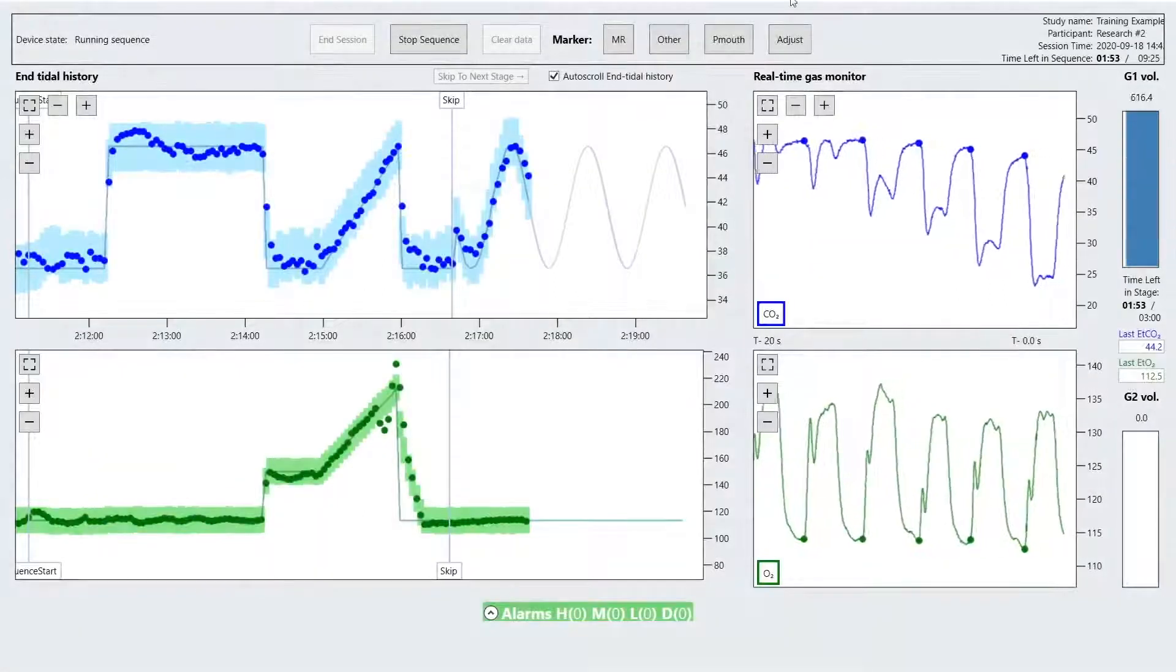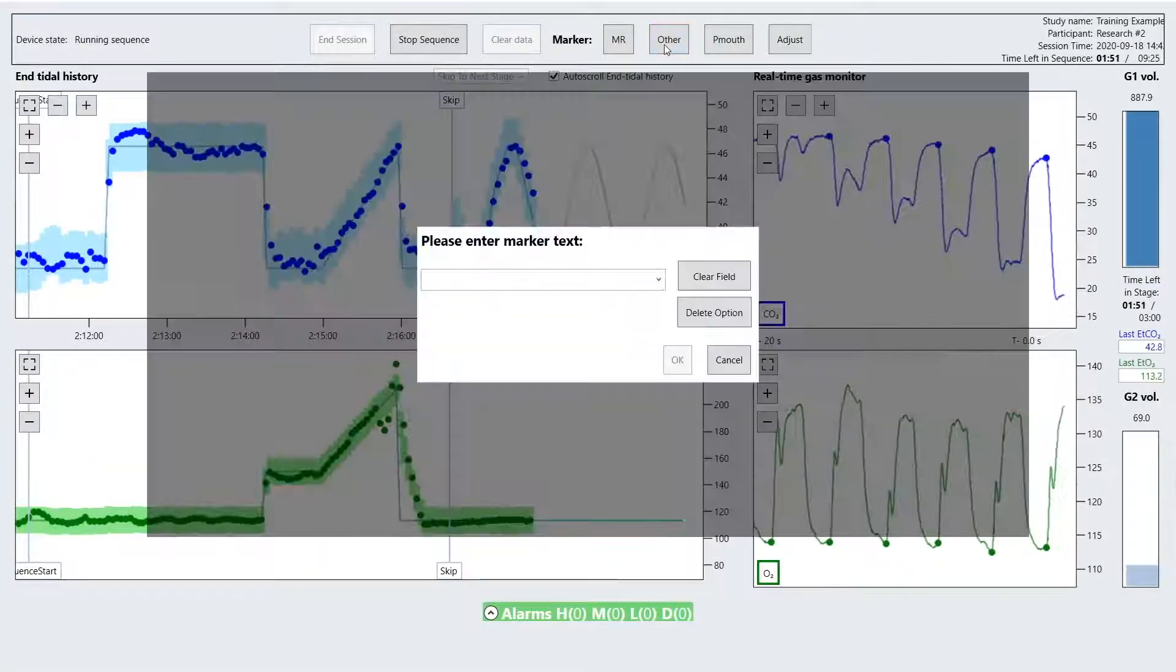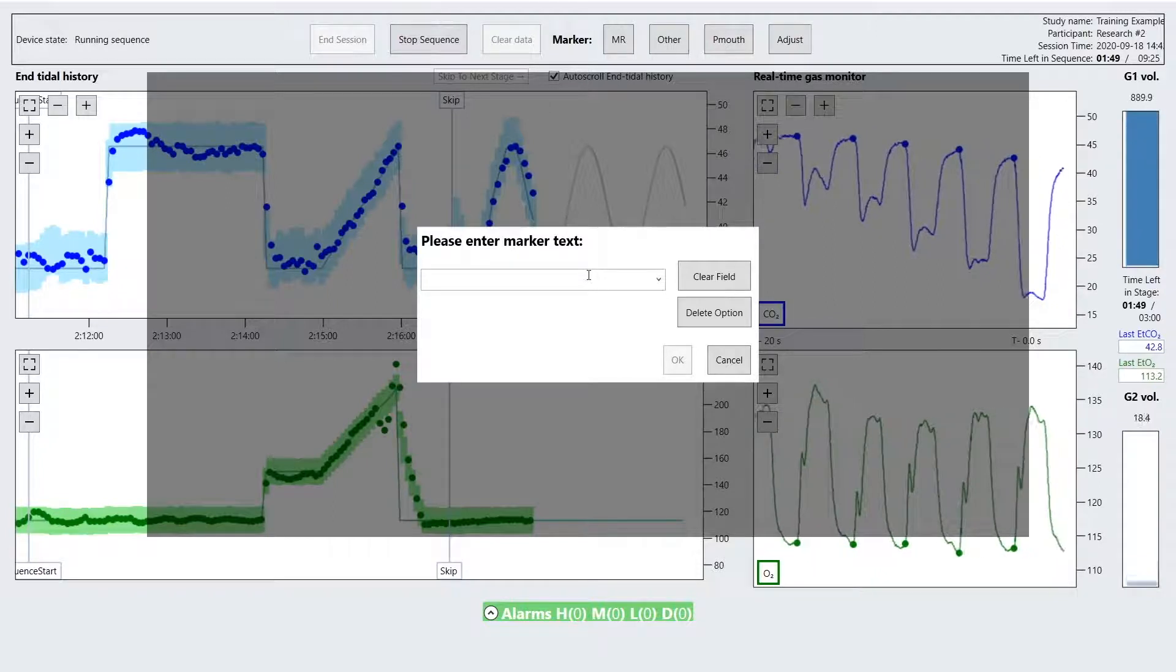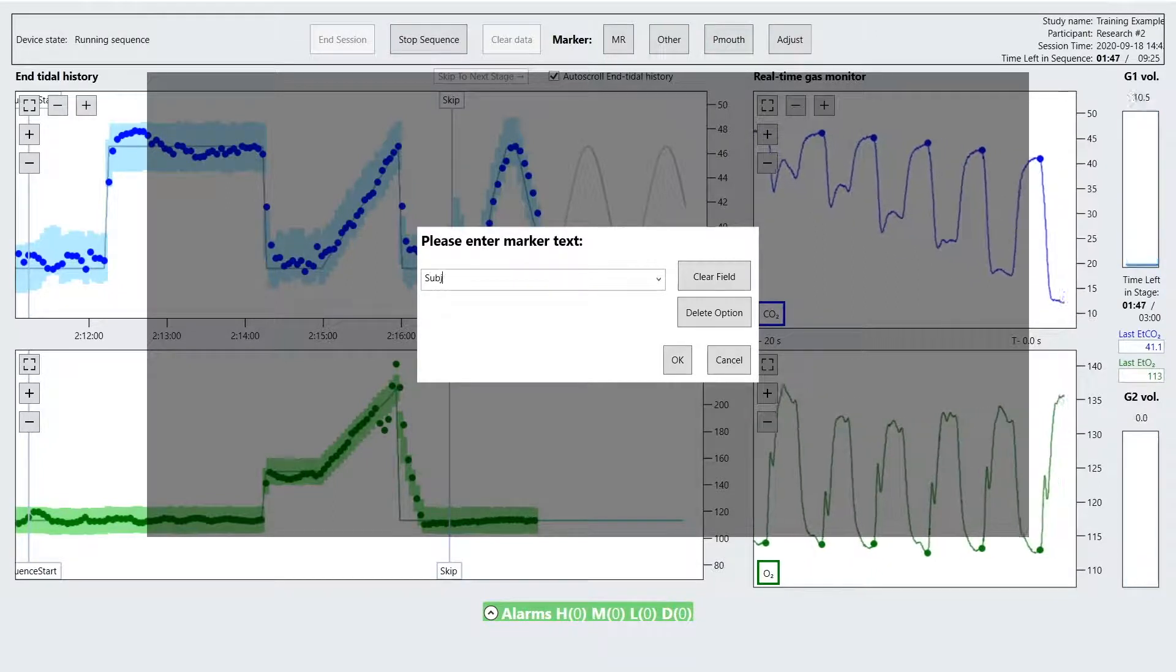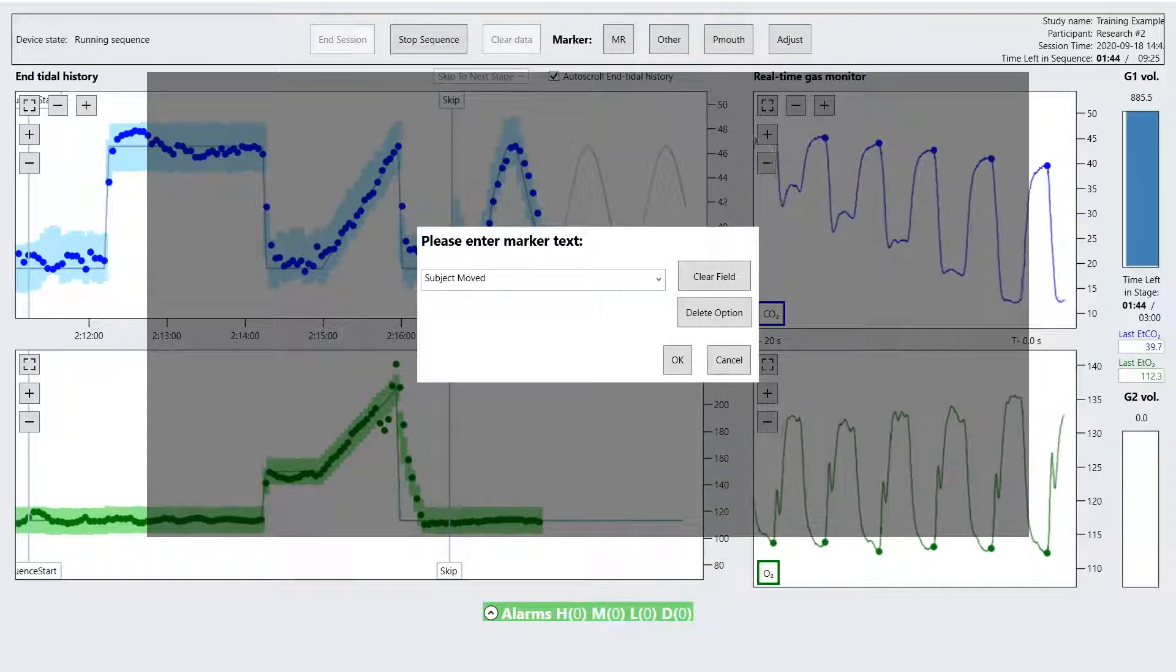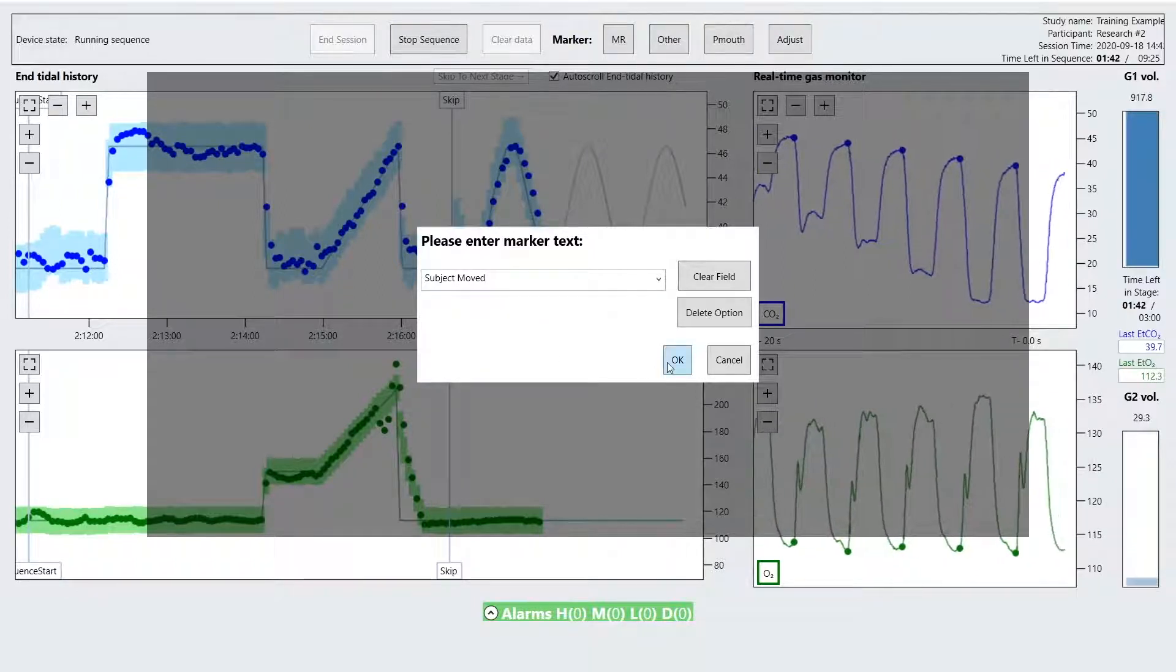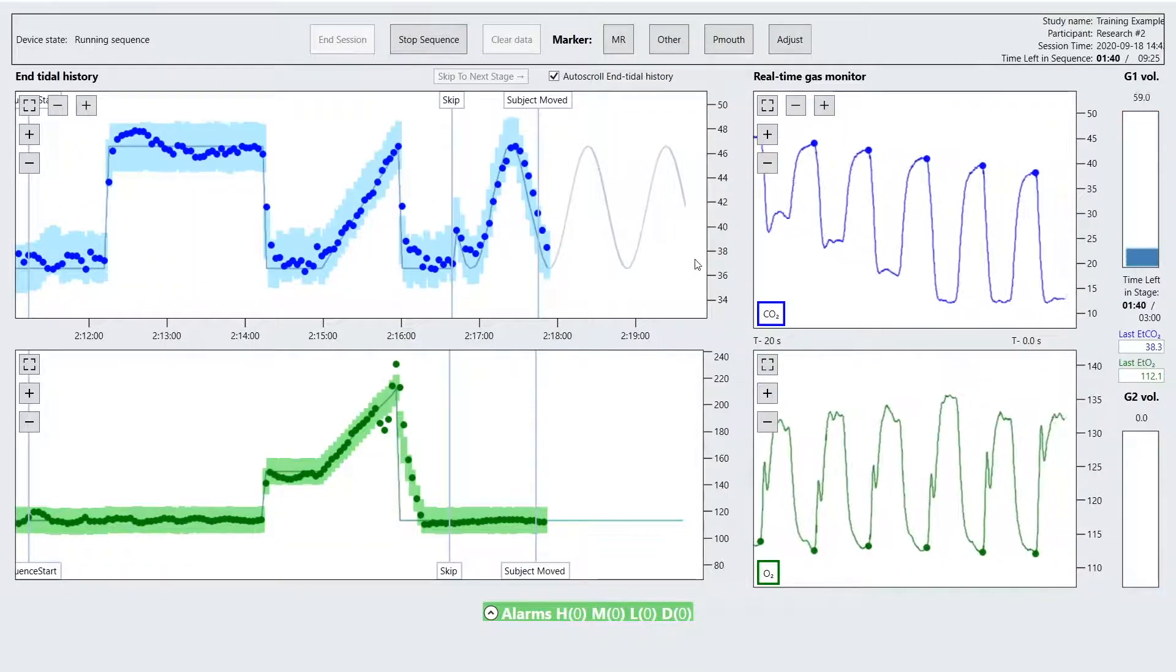The event button allows you to place a timestamp at the current study time. This event flag is then logged into the event text file so it can be referenced at a later time. A description of the event can be entered using the on-screen dialog box during the session.